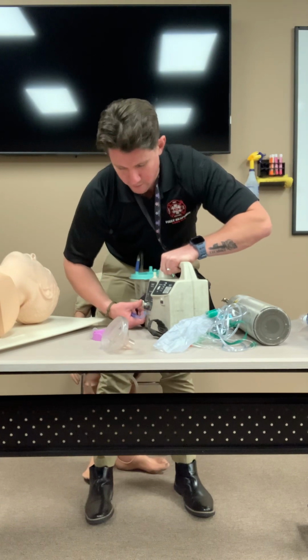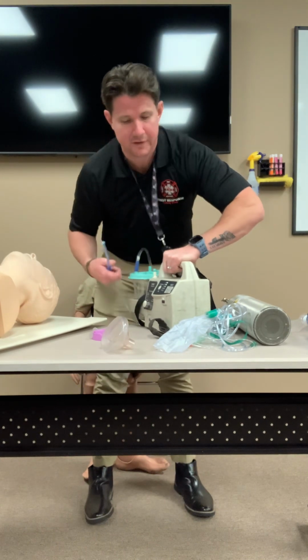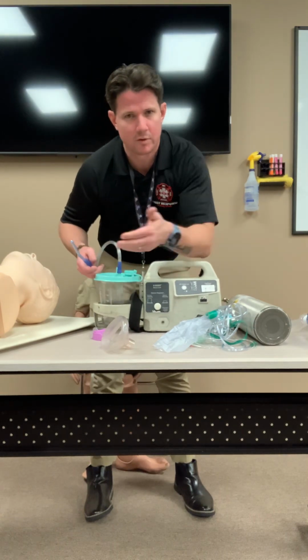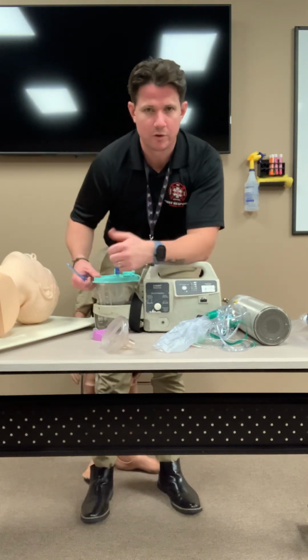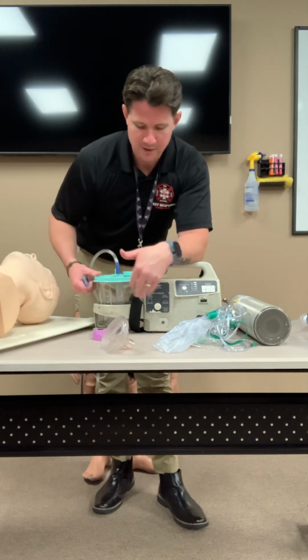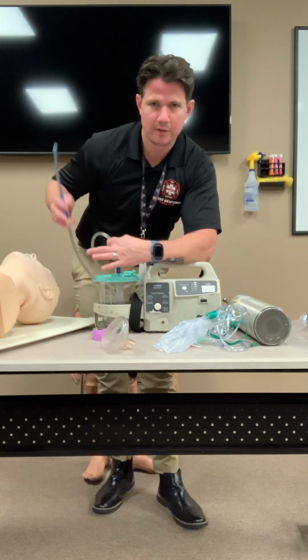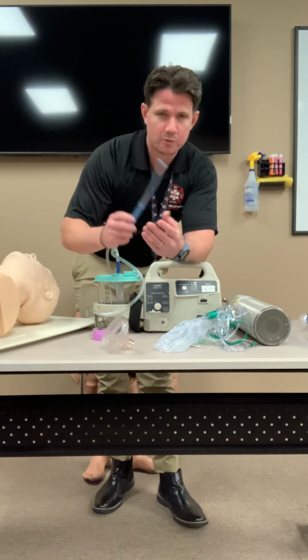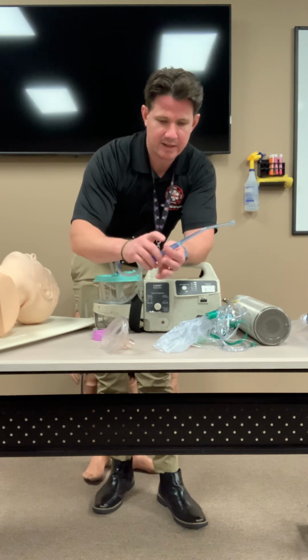So you're gonna want to run this all the way in for oropharyngeal suctioning, right? Put your suctioning numbers, reference those to your book, somewhere around 300 to 350, if you're gonna verbalize numbers like that, okay? So once you have the unit turned on, you have your equipment set up, you've set your pressure, last thing we're gonna do before we suction is check that it's working.